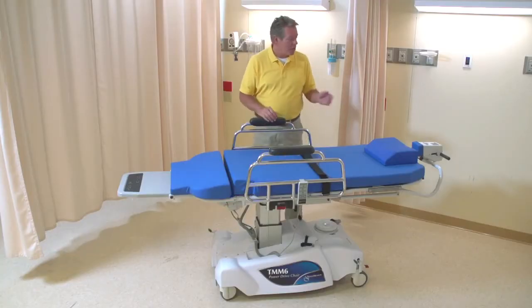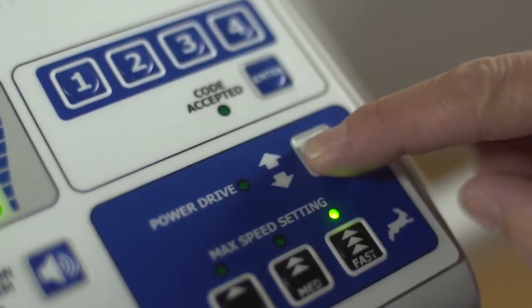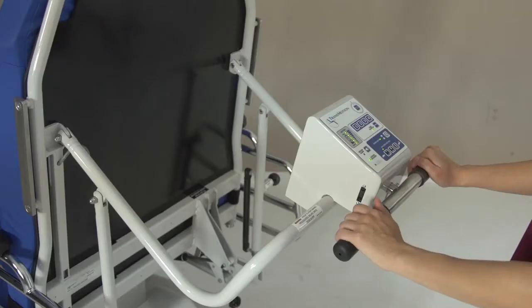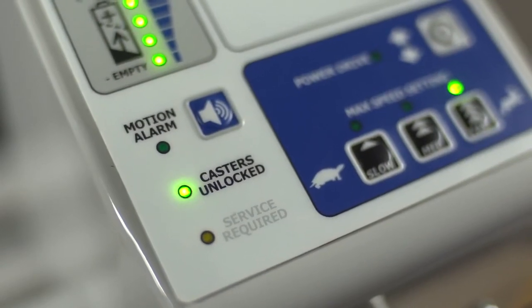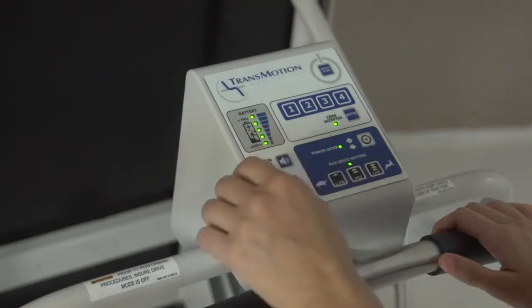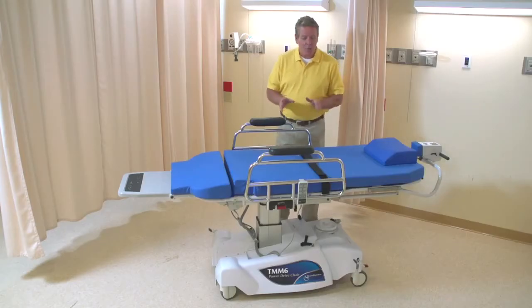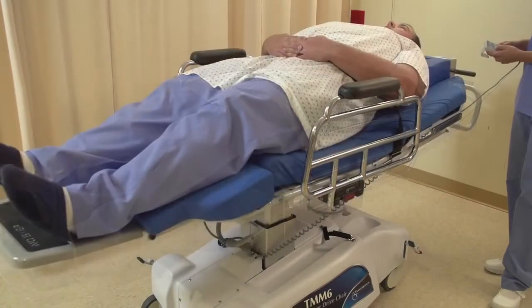The user interface mounted on the back of this articulation tube controls motorized transport. It engages and disengages the power drive, sets the chair's maximum speed, and lets the operator control the drive direction and the pace. The user interface also shows the status of the casters and brake, engages and disengages the motion alarm, and displays the battery level. To adjust the height of the user interface, simply raise or lower the column height of the chair.